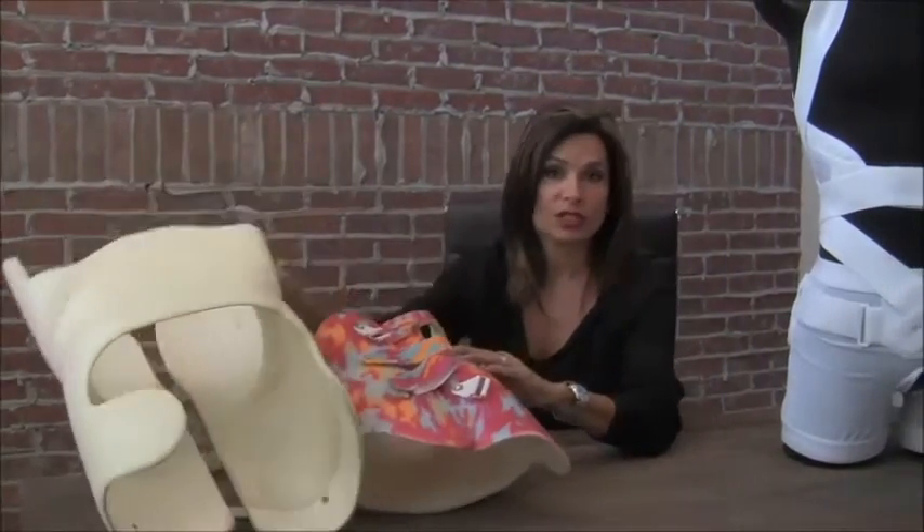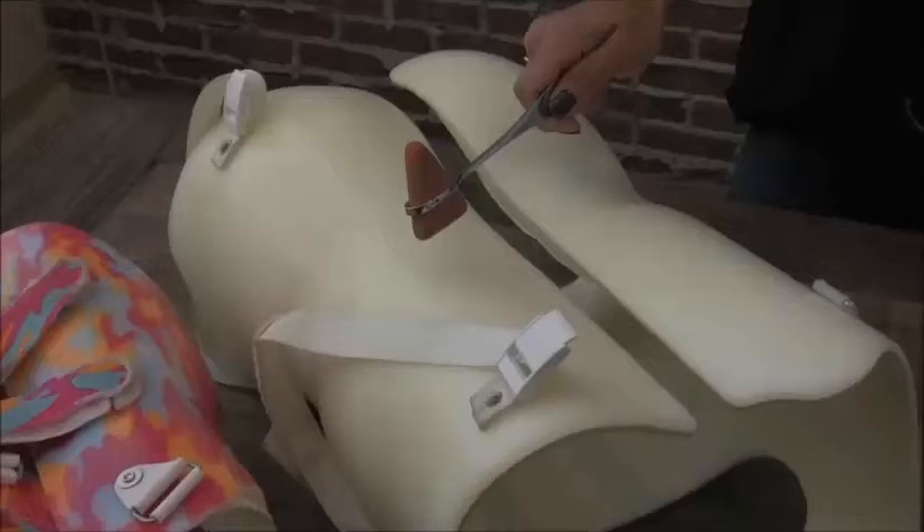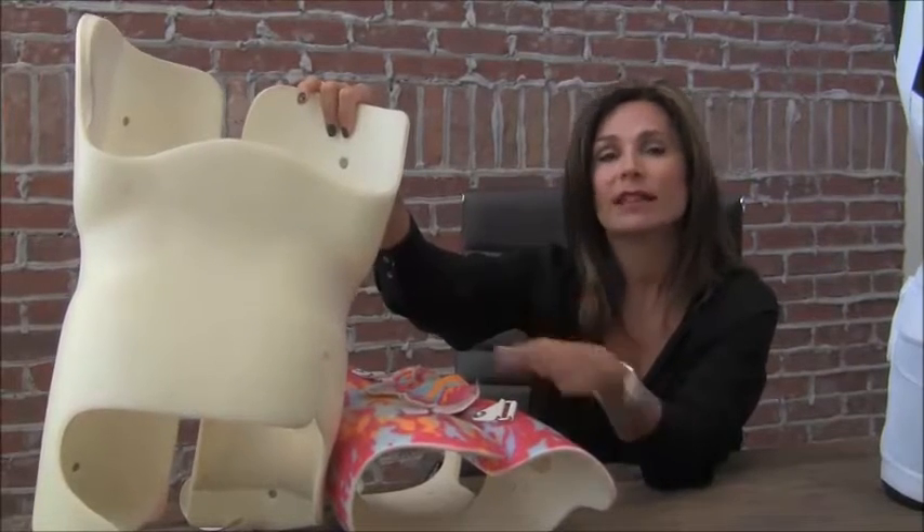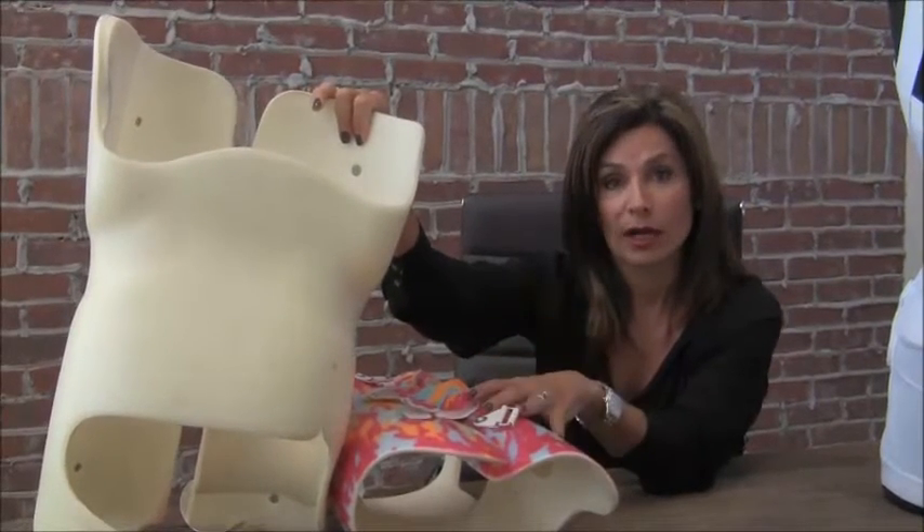Unfortunately, scoliosis is often detected during a time in a child's life when they're involved in sports like soccer, cheerleading, and dance, and they want to be able to continue those activities. This brace does not allow that. You can see how rigid this brace is — it does not allow any movement. It's quite uncomfortable, very bulky, does not fit easily underneath clothing, and kids don't like the fact that all of their friends can tell that they're wearing it.